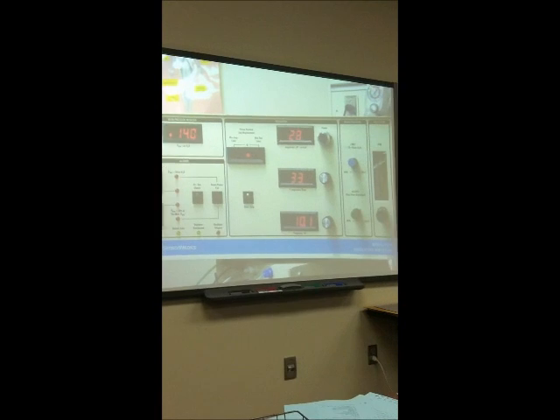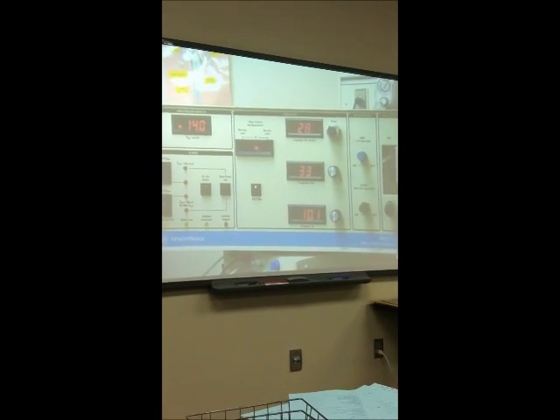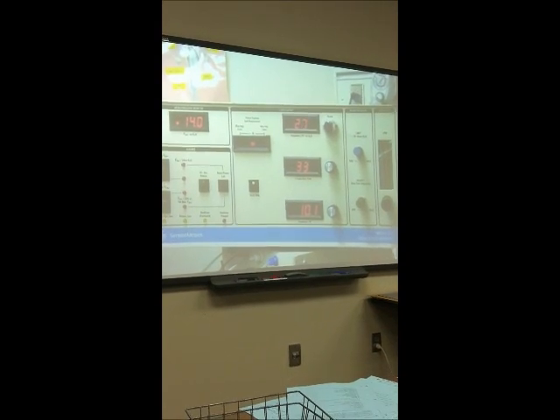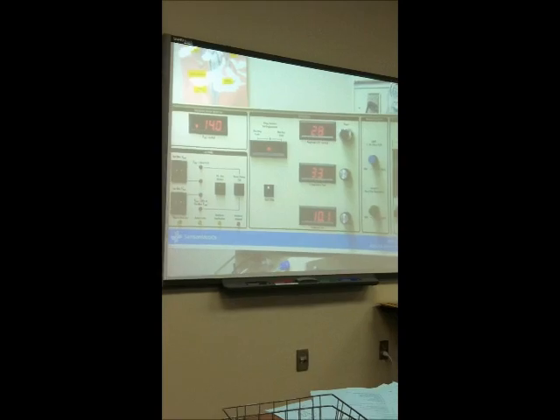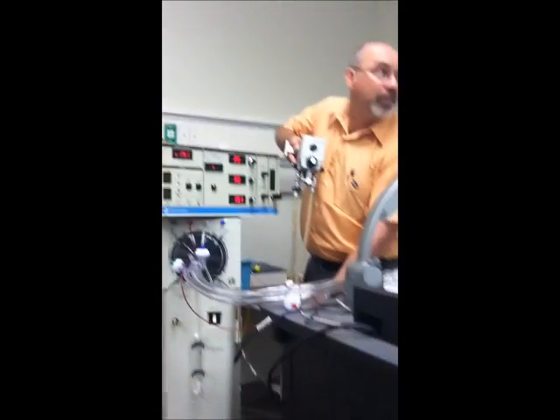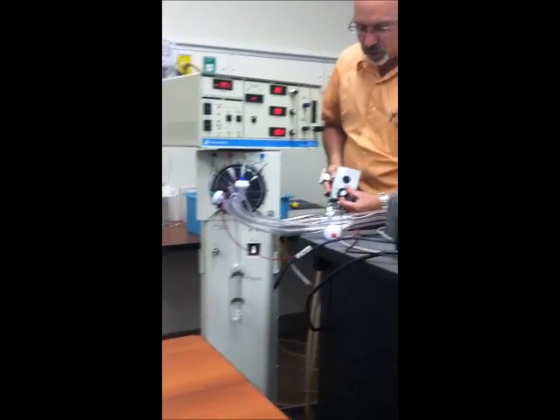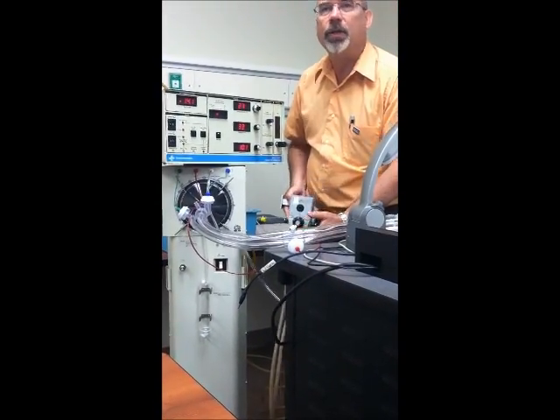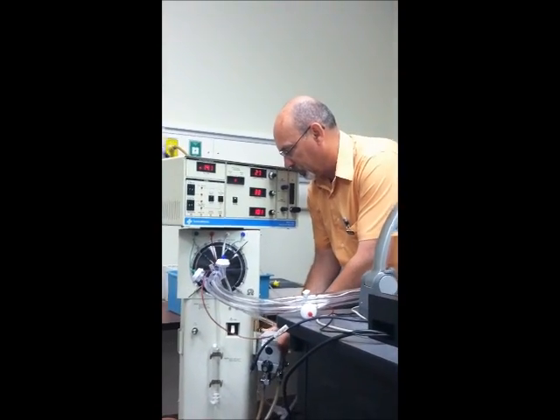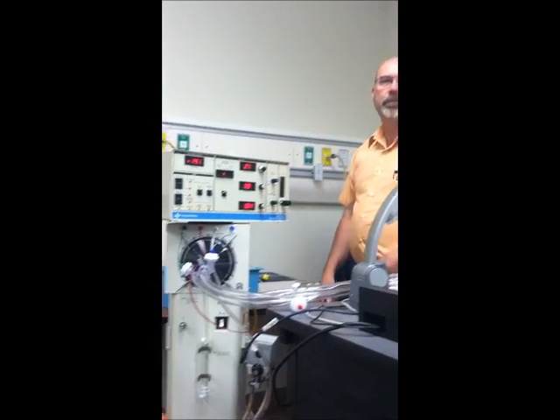Again, this was another one. I don't normally do that. Usually it's still bouncing around, it doesn't stay. But we'll certainly take that. And then I want 40% oxygen. Where do I adjust that? On my blender, that's kind of hung down here. Okay? So you turn your blender to 40% and you confirm it with your analyzer. We will have an analyzer for the checkoff, or no?